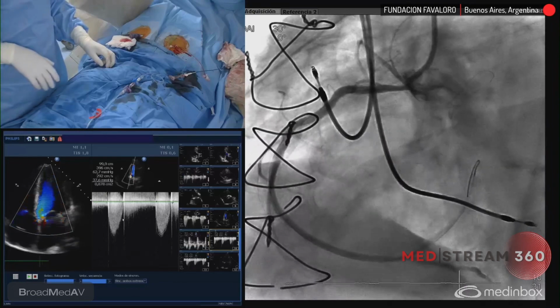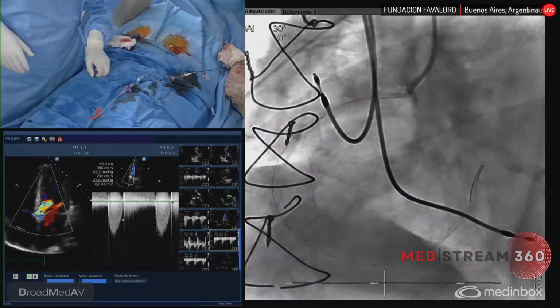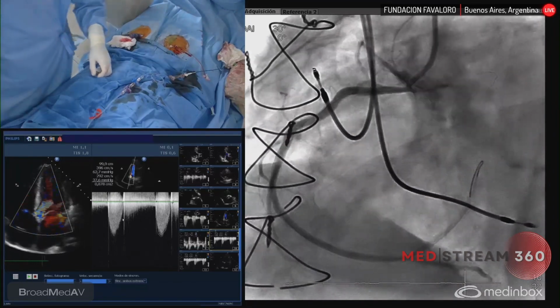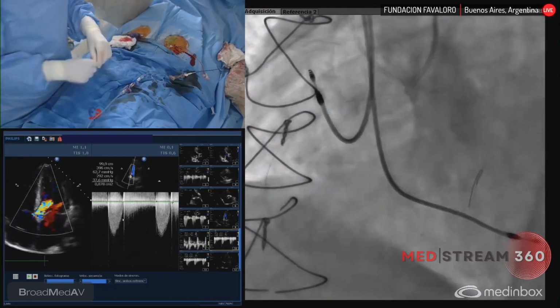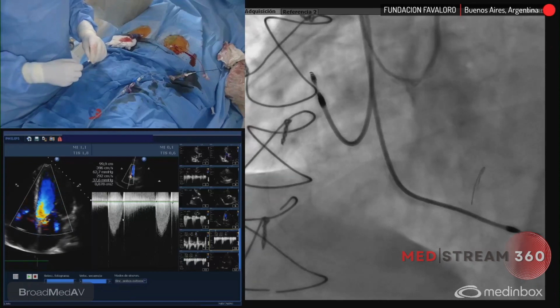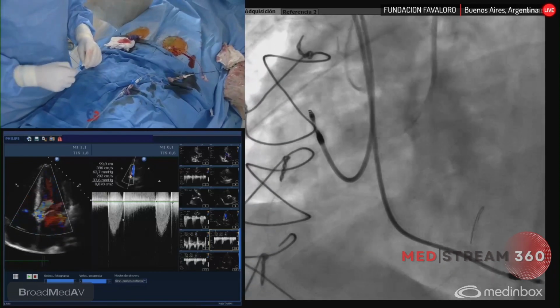We can check the positioning for deployment of the valve just in case we have to rush. Bring another stent. 15 is too short. Or 18. Give me the pigtail. Let's move. Cutting 2.5. So let me cross the valve. It's not that easy when it's a prosthetic surgical valve.